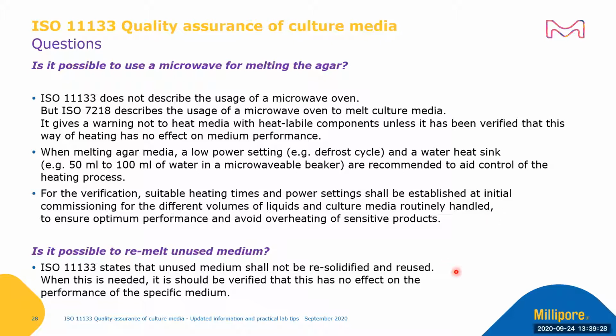Is it possible to remelt unused medium? ISO 11133 states that unused medium shall not be resolidified and reused. When this is needed, it should be verified by the user that this has no effect on the performance of the specific medium.